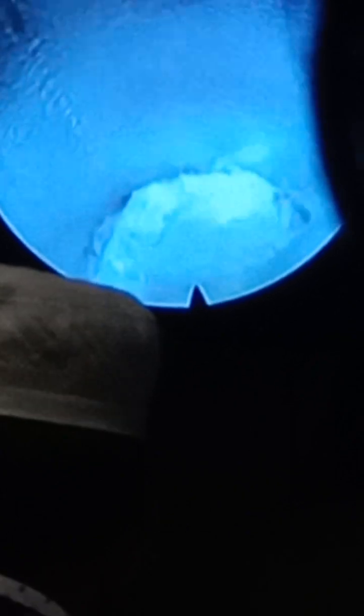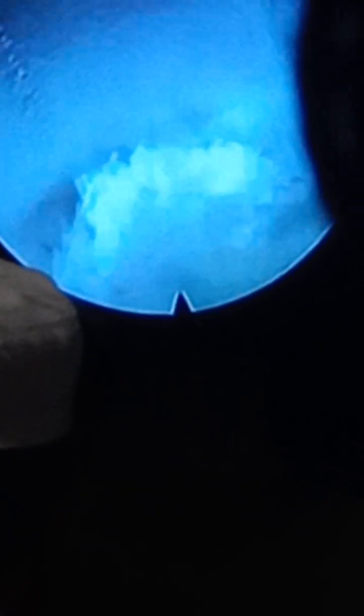We also have a knife which can go through the scope. So we cut the annulus like we do it in the regular microdiscectomy, and then you can see the disc just pops out. We use the grasper to remove that. So there is absolutely no bony resection required if you have a big interlaminar window, and you can just directly land onto the target. This is a big fragment. Now we will remove it.